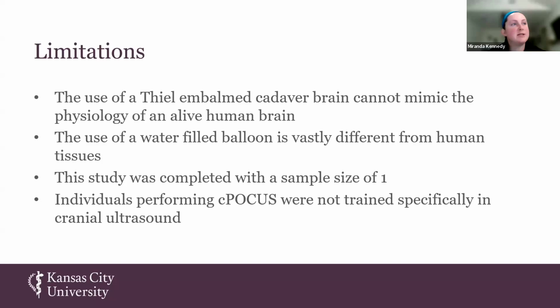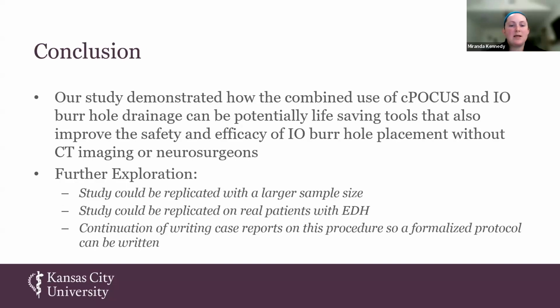In conclusion, POCUS is a non-invasive portable imaging tool that is widely used to aid in diagnosing a variety of pathologies. While non-traditional methods to treat emergent intracranial hematomas have been reported, none have utilized cranial POCUS as an adjunctive modality for diagnosis and treatment in adults. Therefore, this cadaveric feasibility study demonstrated a novel approach to the diagnosis and management of emergent intracranial hematomas through the use of cranial POCUS.